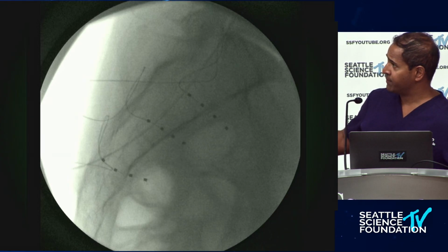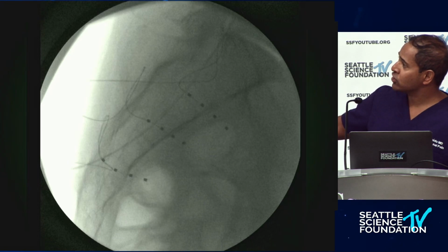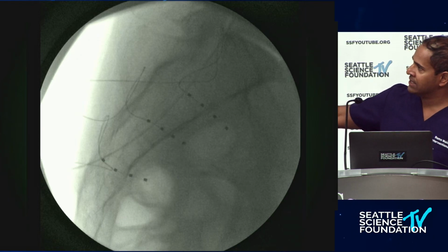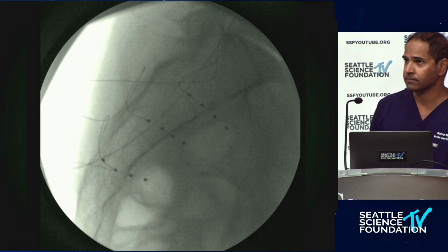So what do we do? We go to the space of Naidu, which is this fake space on the posterior aspect of the sacrum, where I can shove in the lead. And what that does, again, is allow the patient to move without creating any movement of the lead. So I always try to get epidural. Sometimes I can do it at S2, but the percentages are like 50% for me personally, where I have to go extrasacral. And it's a very easy technique. We take the sheath, run it along the posterior aspect of the sacrum, feed the lead, retract the stylet, and you can go up and down with that if you want.